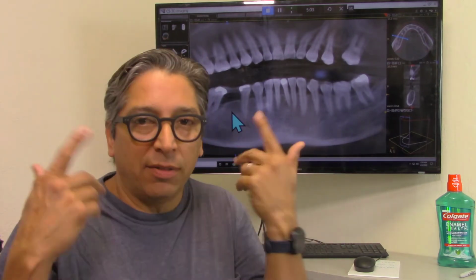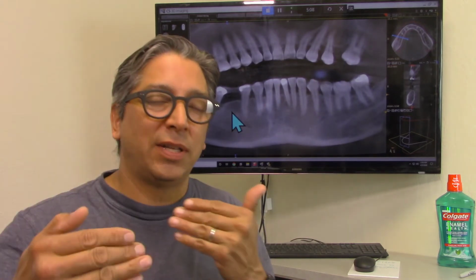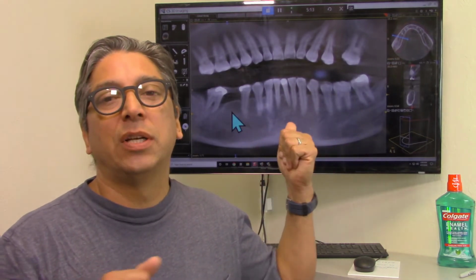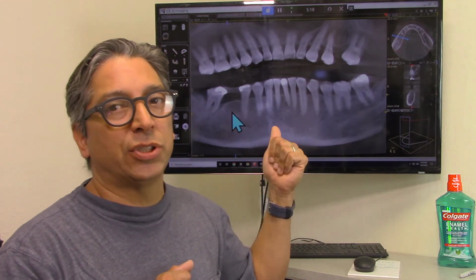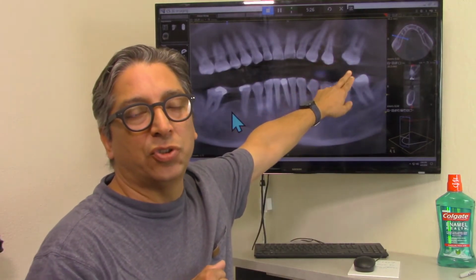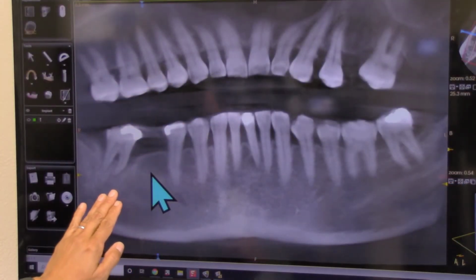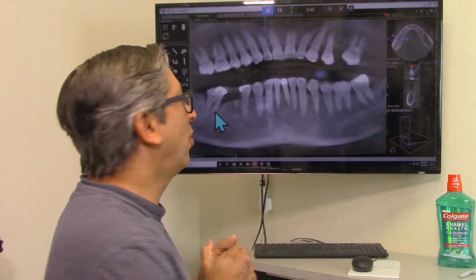I think that's how this goes over time. I've seen patients where money always prevents them from seeking care along the way, and that prevents treating periodontal issues and tooth loss issues like in this case. Now, she's actually not interested in restoring this up here, but the warning shot for her is that she will be losing that tooth very soon. And this one is the one that brought her into the office. So this one is an easy extraction. There's really nothing to extract because its biology is actually doing it for us.